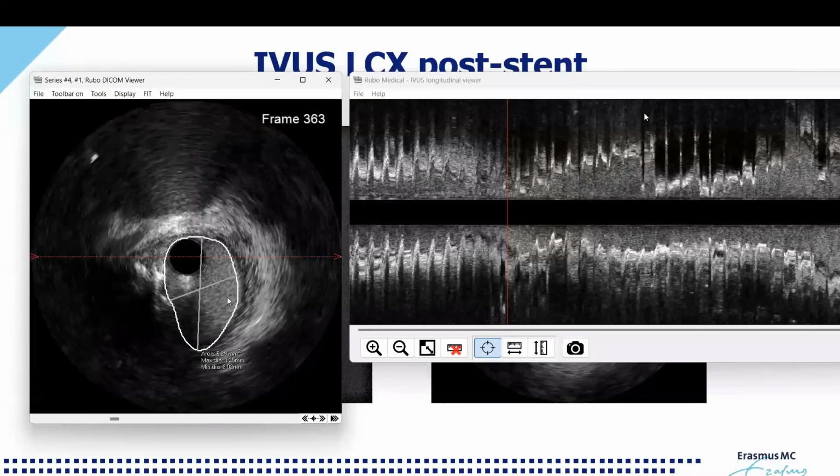So here we see the lumen area 5.29, but now we have to go for the total vessel area. Total vessel area I always measure on the media. I hear voices, EEM, etc., external elastic membrane. Forget it, because you can't see that membrane.